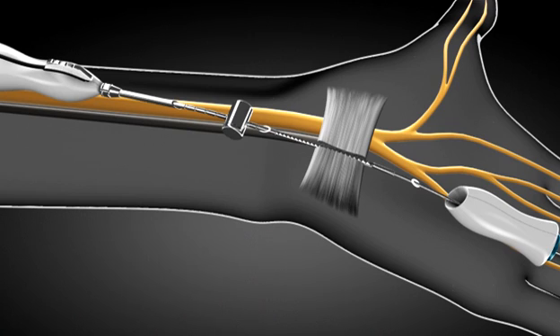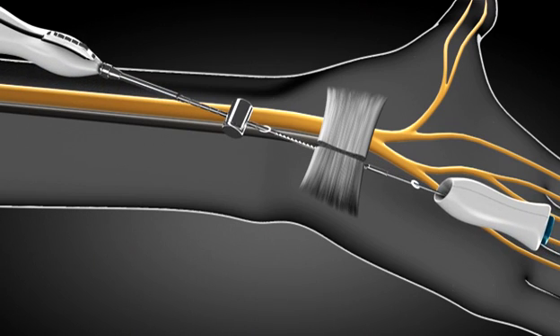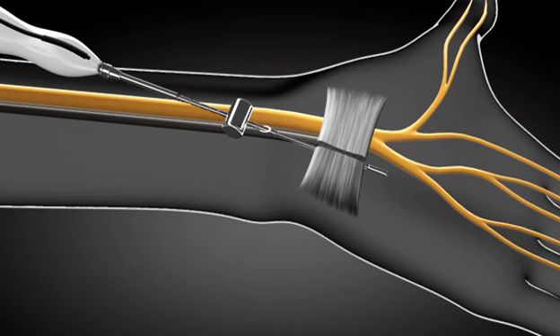Once the ligament is released, the thumb button on the distal handle is pressed to release the carpal tunnel release blade. The thumb lever on the proximal handle is then retracted to its original position, safely returning the cutting surface inside the carpal tunnel release blade assembly.